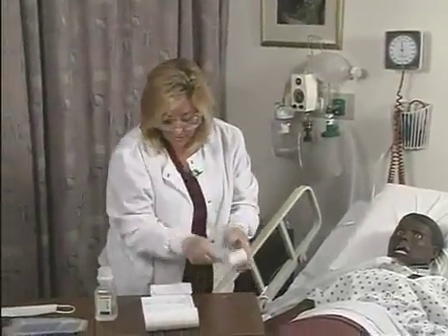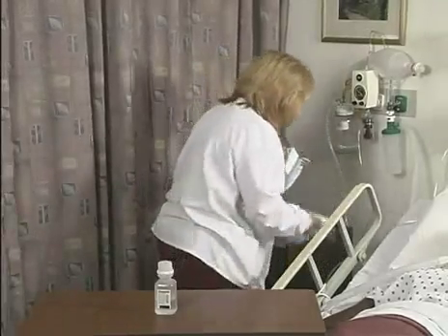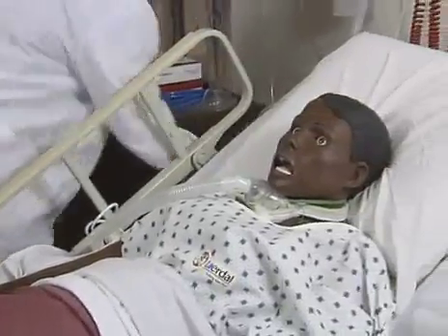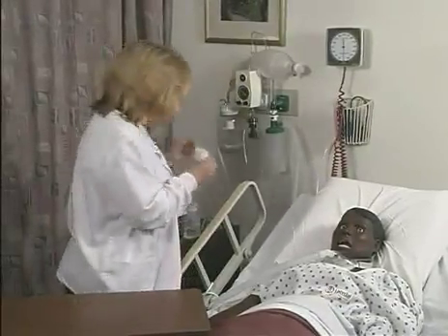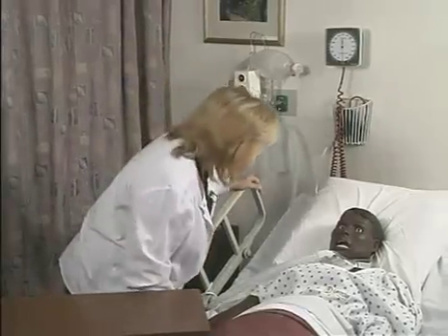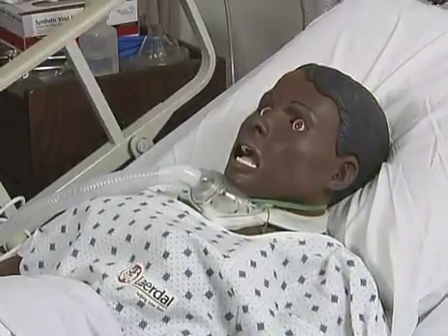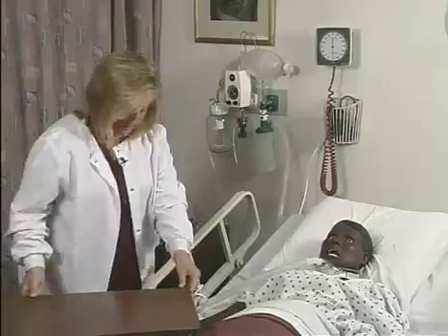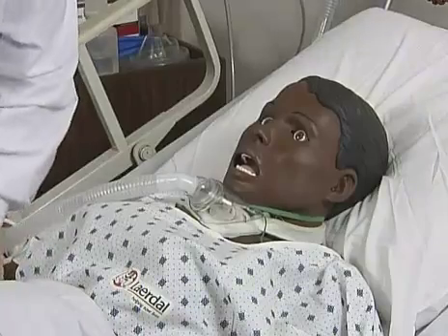Now I'm going to dispose of the equipment. Now I can take my gloves off, as well as my personal protective equipment. Mrs. Jones, you did very, very well with this procedure. I'm going to lower your head. Would you like your head lowered? Are you comfortable? Very good. And here's your call bell. I will be back in a little while. That was a demonstration of the suctioning and tracheostomy care in a simulation lab.